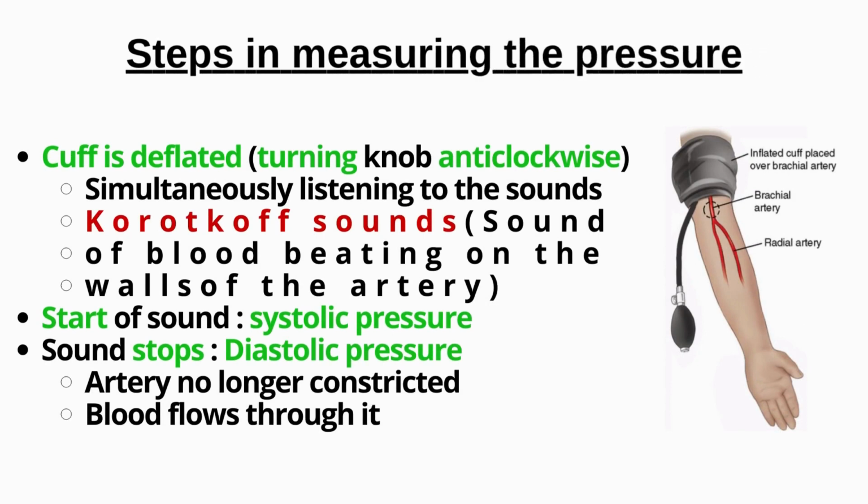Step 4. Release the pressure. Once the cuff is inflated, slowly release the pressure using the release valve. As you release the pressure, listen carefully to your pulse with the stethoscope.